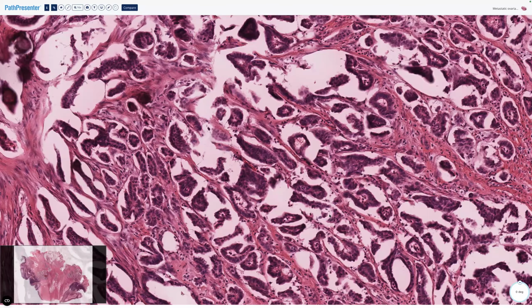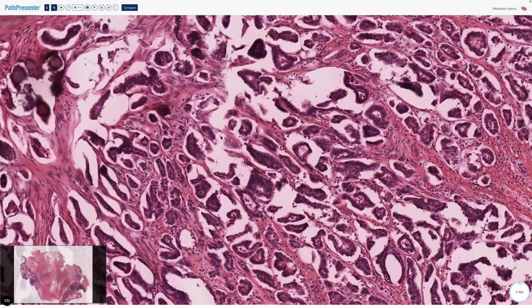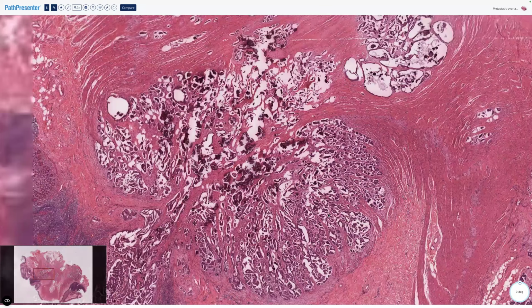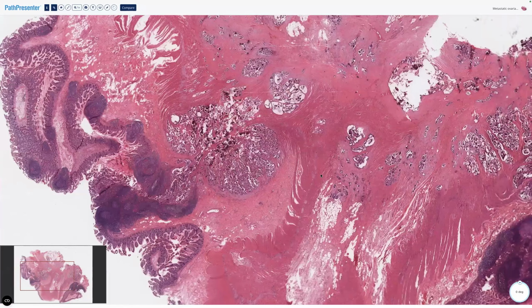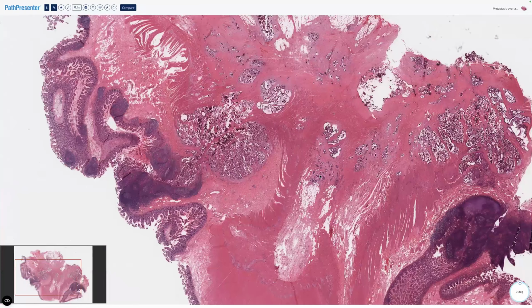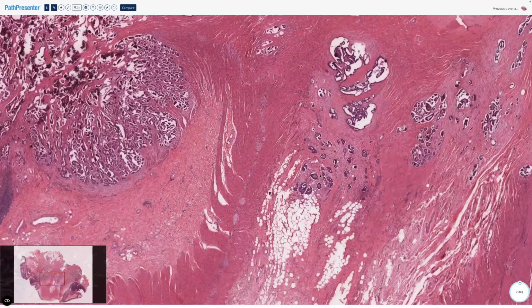The other one is the solid pattern, and that's where I usually have to do immuno. These have usually spread because they're very spready, and the ovary is very deep and really doesn't get detected early just because it's so deep. Let's have a look for some other patterns because it can grow in other patterns.